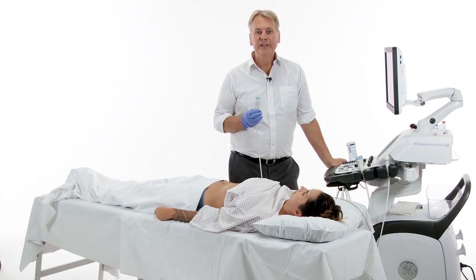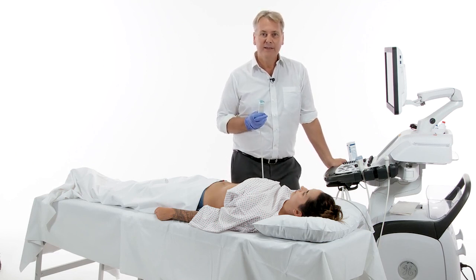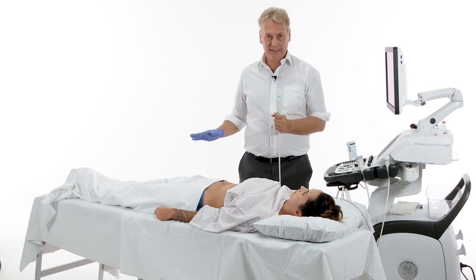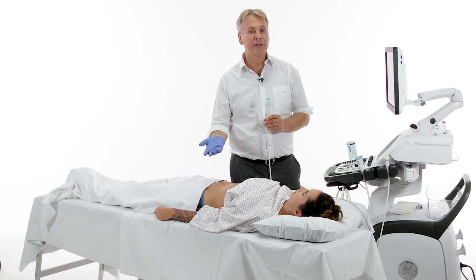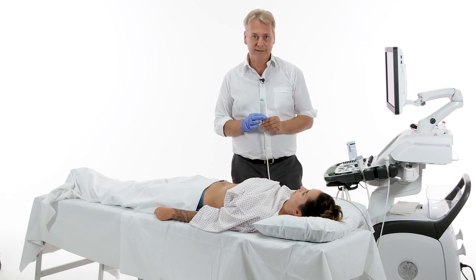In most patients, you will need to put the patient on his back. Sometimes it's of advantage if you angulate the knees because it reduces the tension of the abdomen. In reality, however, you can even perform subcostal views of patients lying on their left or even on the right. And to be honest, I never really raise the legs or angulate the knees.